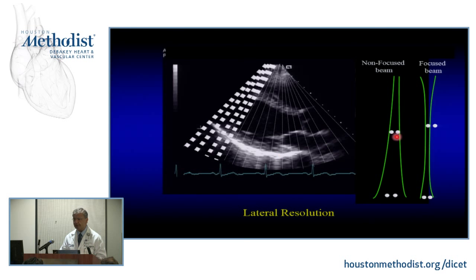But irrespective, your lateral resolution, differentiating two dots close together in the lateral space as opposed to the axial space, really will depend on the beam and focusing of the beam. So I think that's going to be very important for you. And overall, in general, lateral resolution is lower than axial resolution. That's why, again, for you to be in the axial resolution, you'll be perpendicular to that, right?